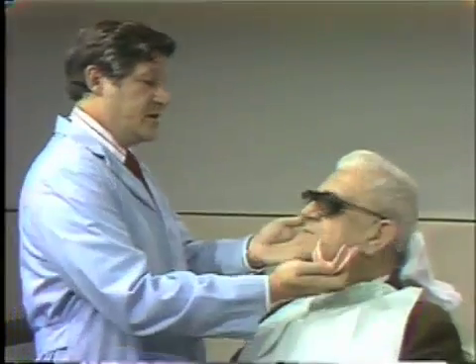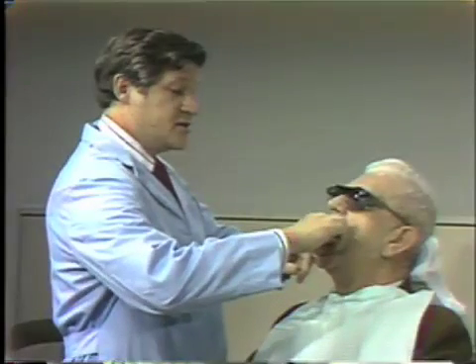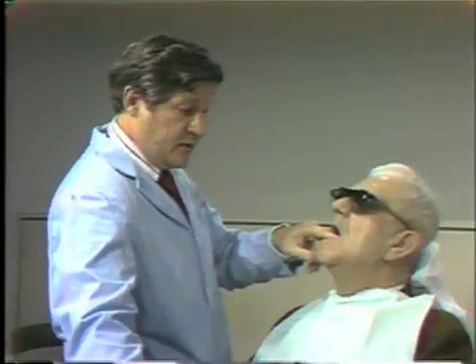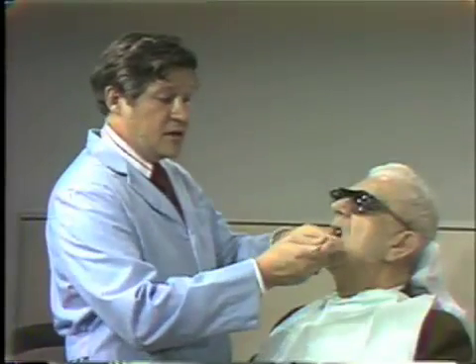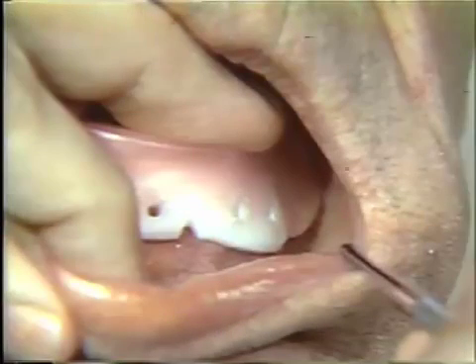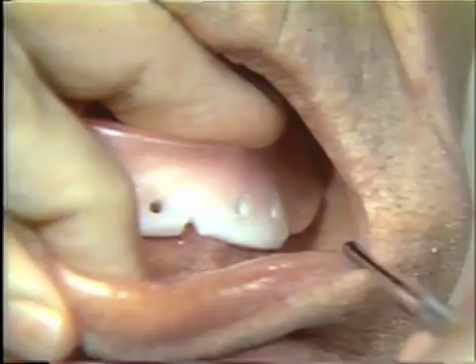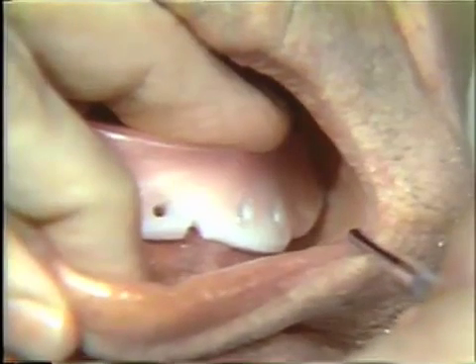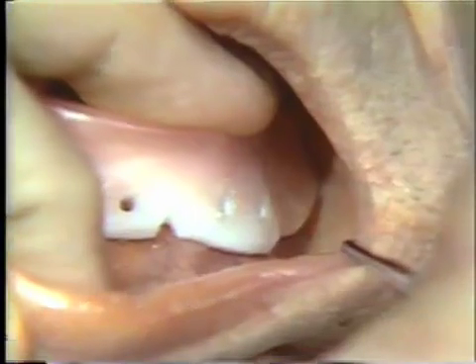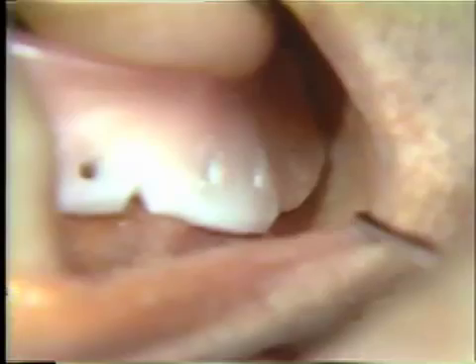Just lean your head back, Mr. Monaghan. We're going to insert this tray into the patient's mouth, seat it over the residual ridge area, and then reflecting the cheek we can begin to look at some of these areas. You'll notice that the left labial flange is properly extended, while the left buccal flange in the posterior region is well short of the peripheral role. In fact, you can see that there is a space that exists beneath the flange of the impression tray to the sulcus depth.